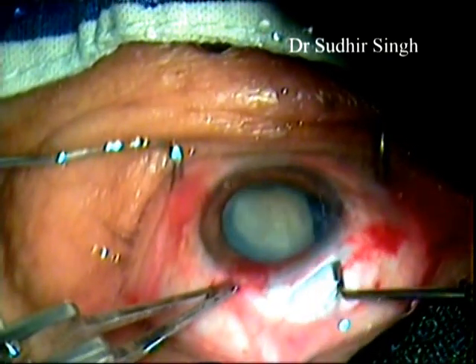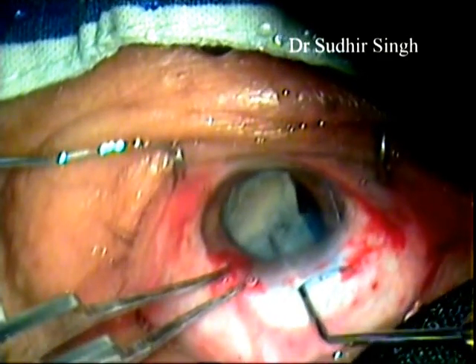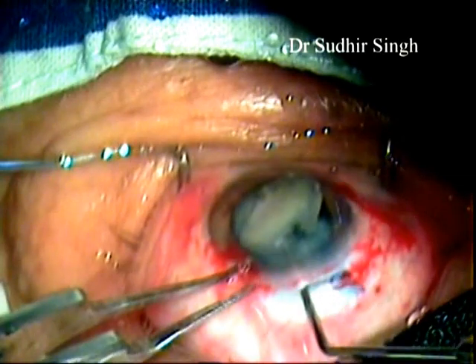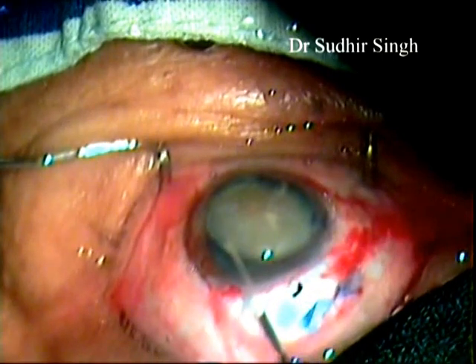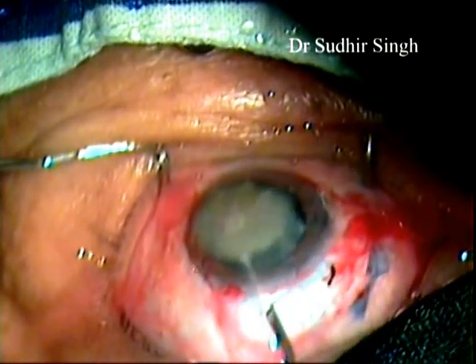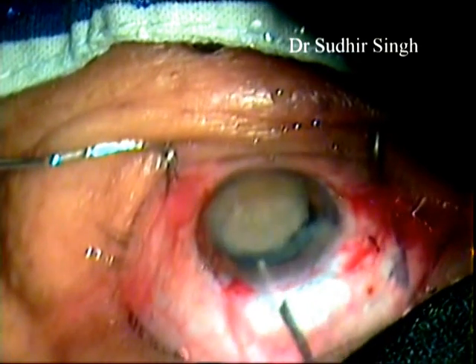The nucleus is rotated within the capsule and prolapsed into the anterior chamber by a Sinski hook. Enough viscoelastic is placed between the cornea and the superior surface of the nucleus to protect the endothelium, and between the nucleus and iris to keep the iris away from the nucleus.